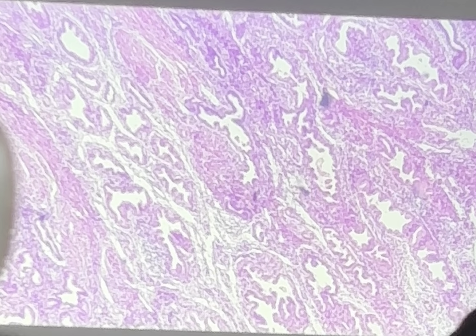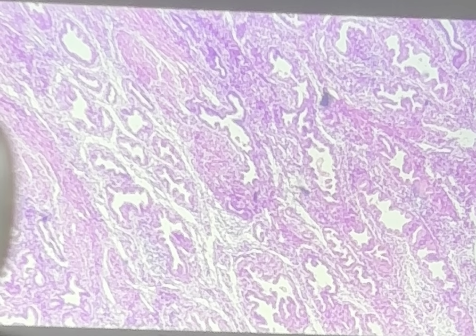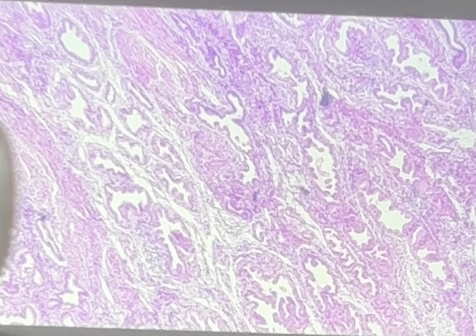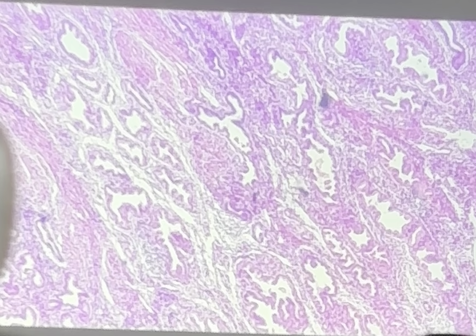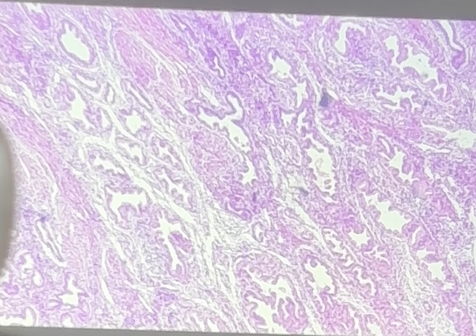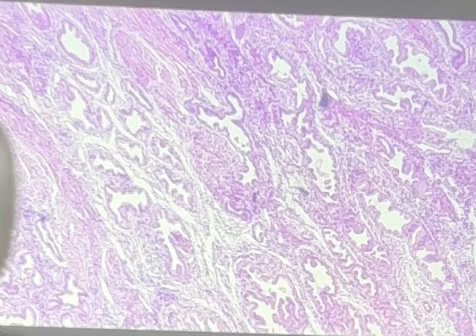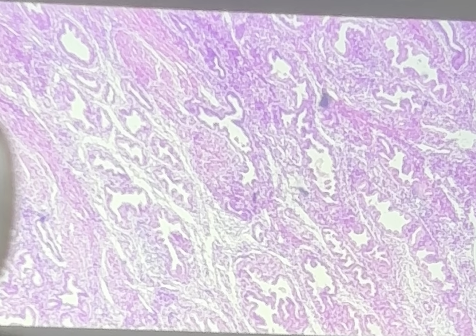You may think it's secretory endometrium, because we do see a little bit of a sawtooth pattern. And you are correct that it is a secretory base, but the way the glands are arranged is too disorganized. It's because they're growing out of proportion. Okay, they're multiplying. This is what we call endometrial hyperplasia. Now, there are two categories of endometrial hyperplasia. You have to call it endometrial hyperplasia without atypia or atypical endometrial hyperplasia.